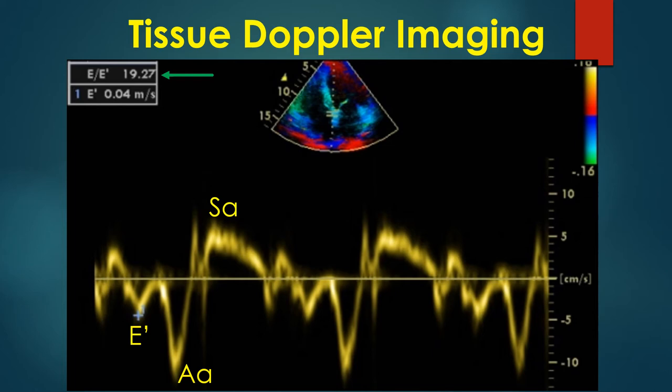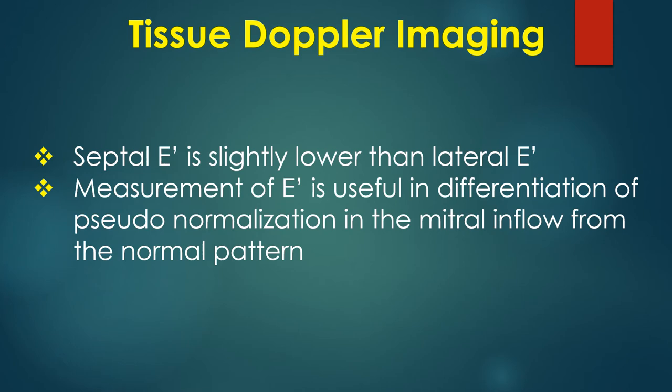The first negative wave is the mitral E prime. The next negative wave after E prime occurs during atrial contraction and is designated AA. The positive wave after AA is the SA wave, representing the systolic myocardial wave recorded as the annulus descends towards the apex. SA at the lateral mitral annulus is a measure of longitudinal systolic function and correlates with left ventricular ejection fraction. Septal E prime is slightly lower than lateral E prime. Measurement of E prime is useful in differentiation of pseudo-normalization in the mitral inflow from the normal pattern.